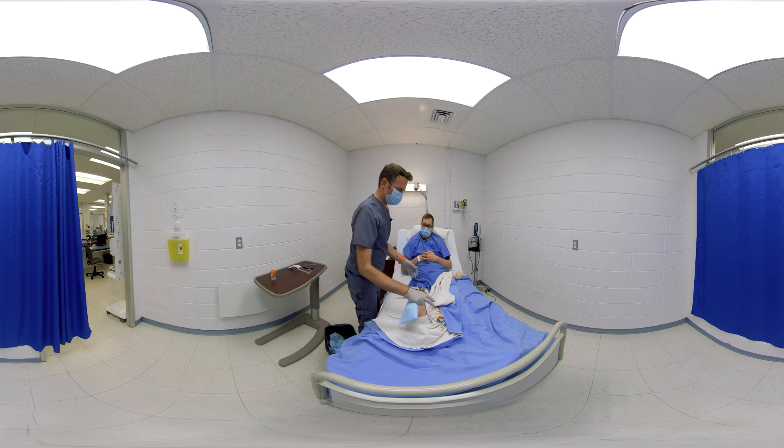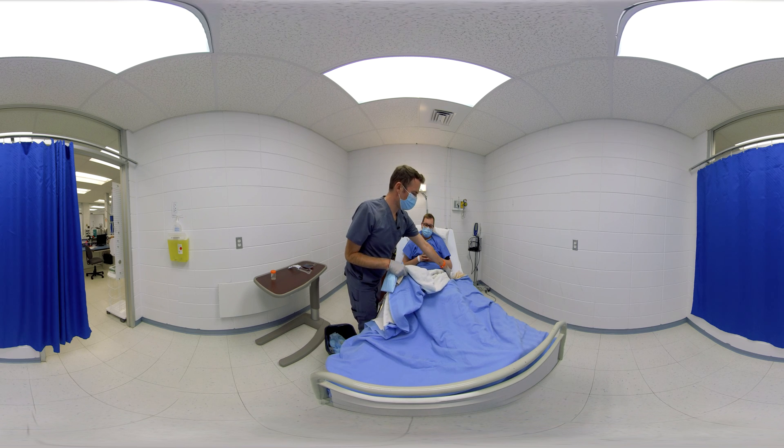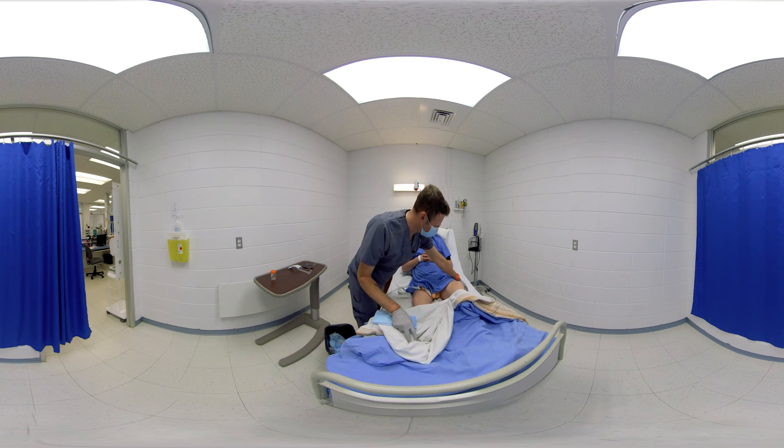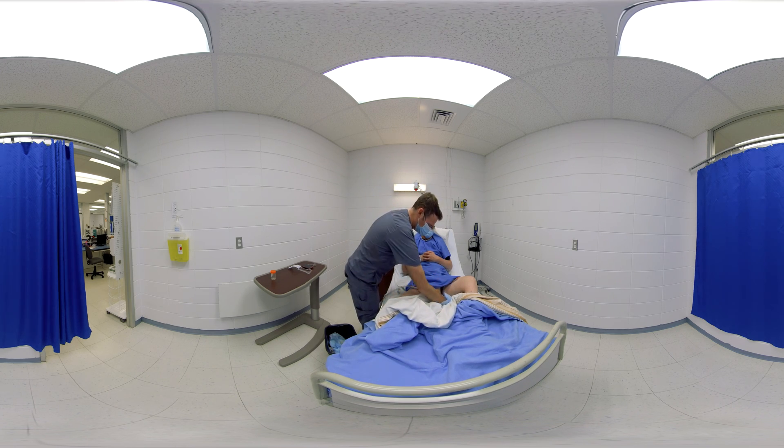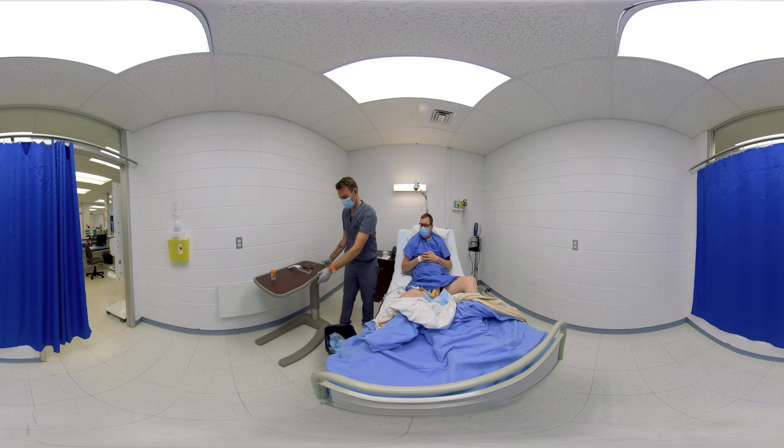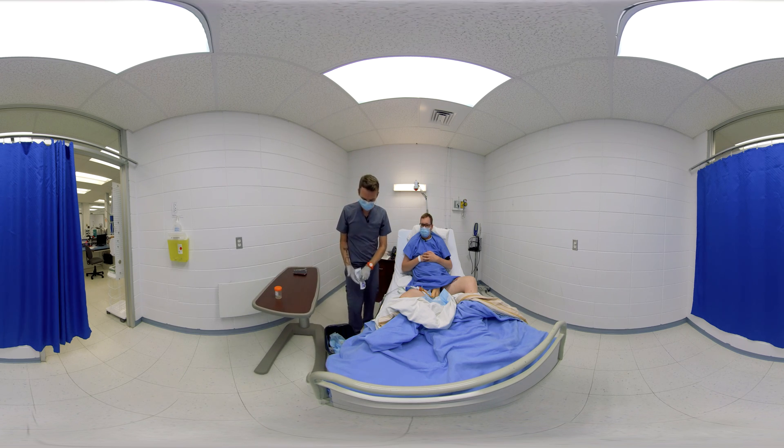This position allows the nurse to see the perineum. Can you please spread your legs a little bit? Thank you. The nurse makes note of the amount and characteristics of the urine in the diuresis bag, and this information is noted in the user's file. Respect for the user's modesty and dignity must be a priority at all times. Placing a pique under the user's buttocks protects the bed linen from soiling during the procedure.